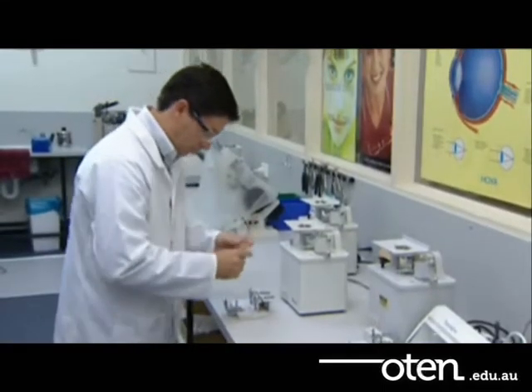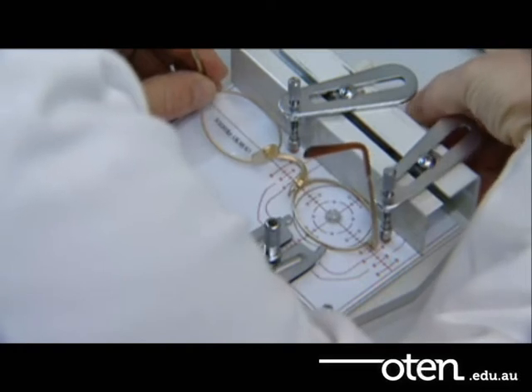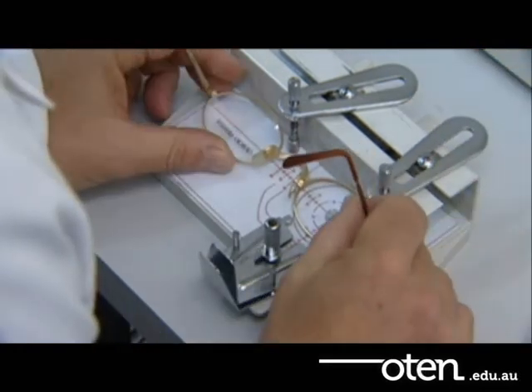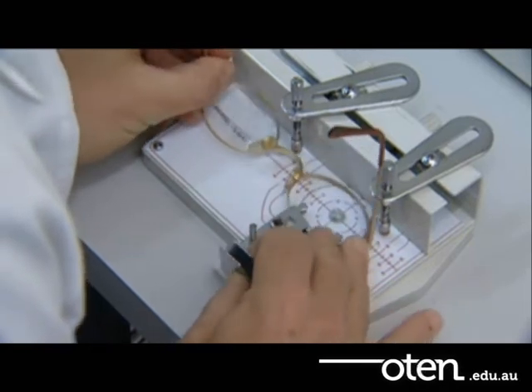Then you need to make a template. You can do this by hand or, more commonly, use the template cutter machine. Measure your template to make sure it's accurate.